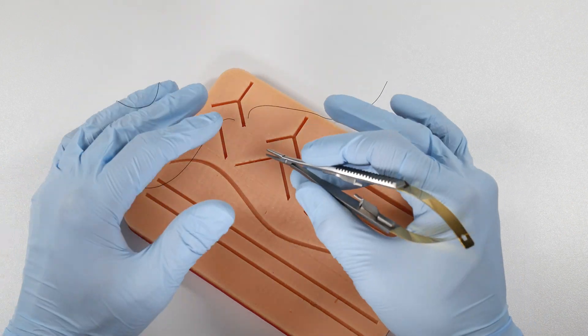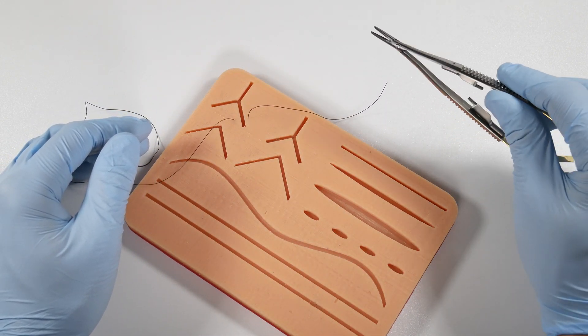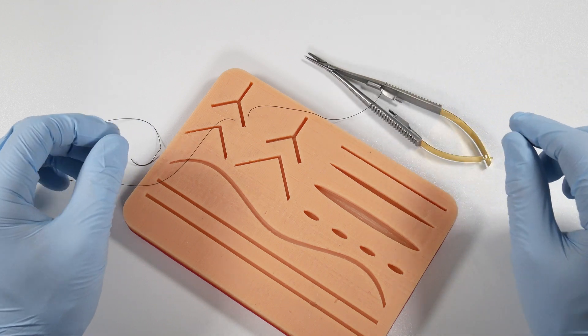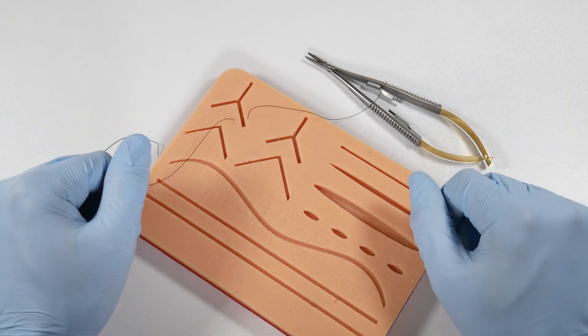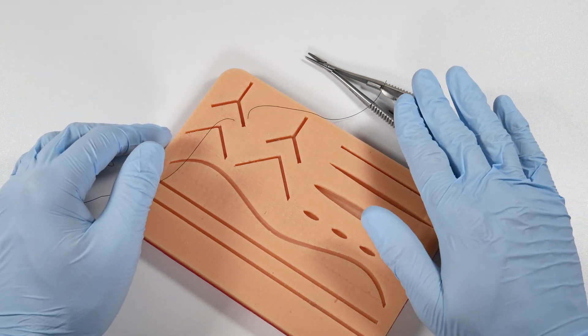You might find that suturing becomes a little more enjoyable, a little easier for you once you have better control over the instrument.